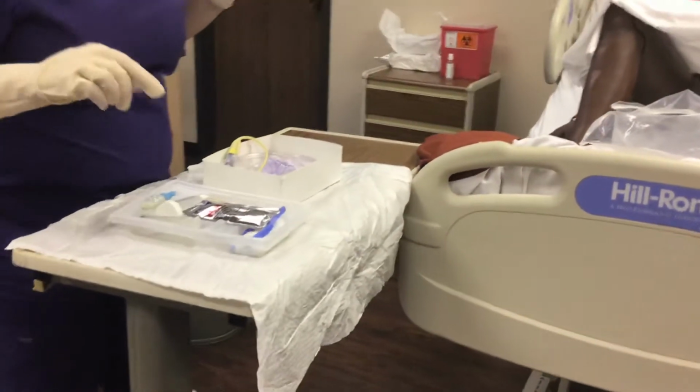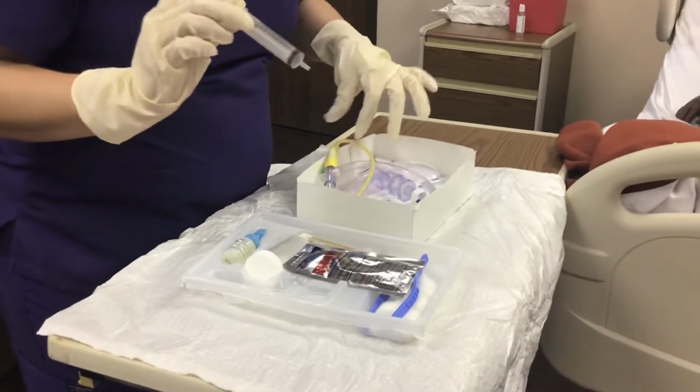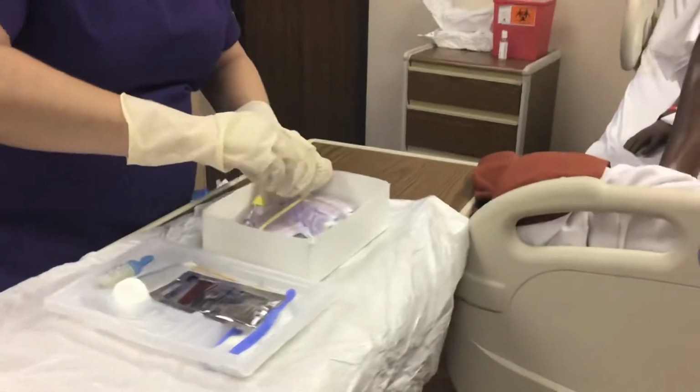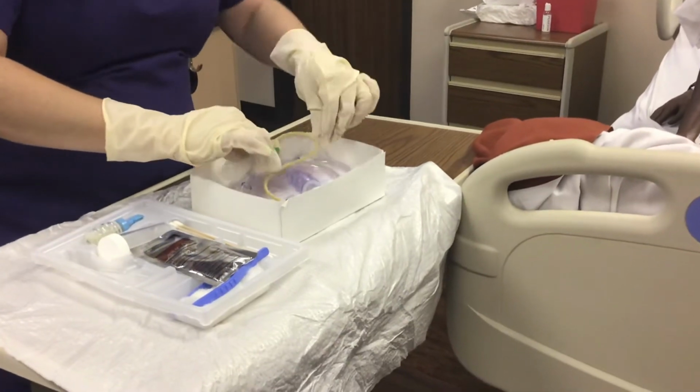Dropping in the trash can. I'm going to pretend with this. I'm not actually going to insert the 10 mils of sterile water into the balloon. Okay, so that is done.